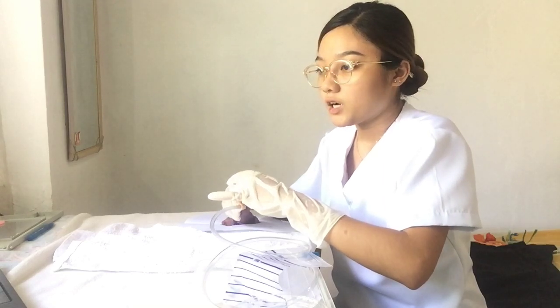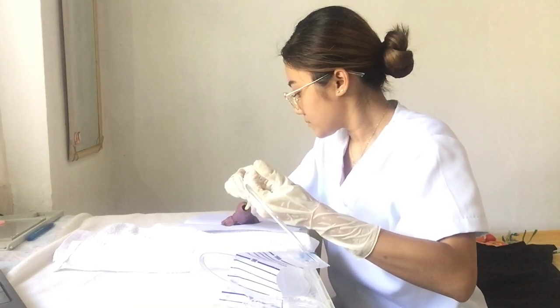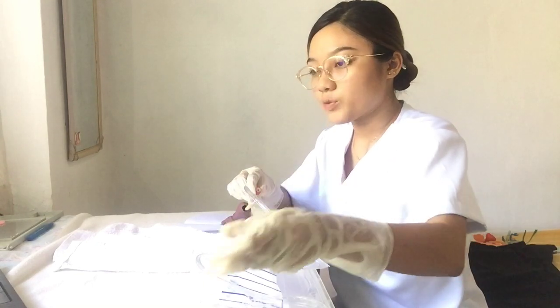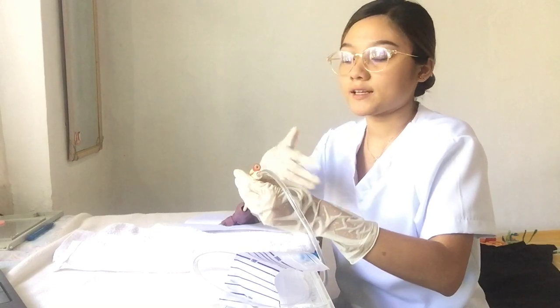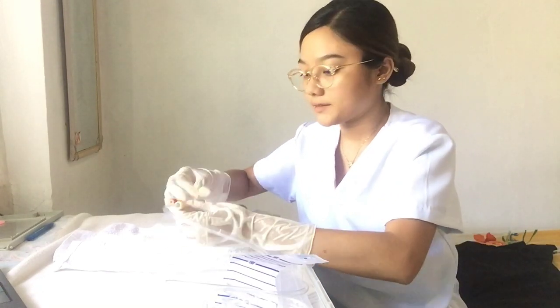Inflate the balloon with the pre-filled syringe. Then check for placement by gently pulling on the catheter. Connect the distal end of the catheter to the drainage bag if necessary. Secure the catheter tubing to the patient's thigh or abdomen using a Velcro leg strap or other securement device, leaving some slack in the tubing to allow for patient movement.